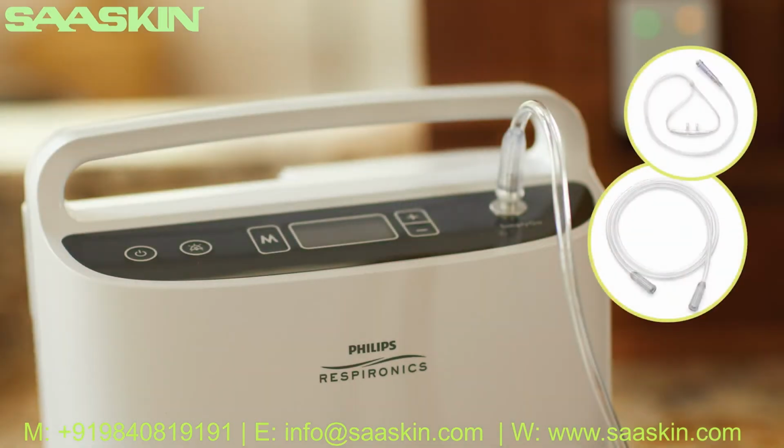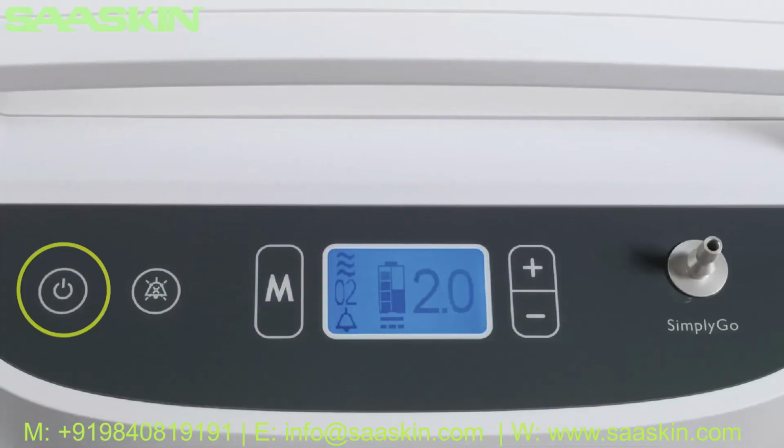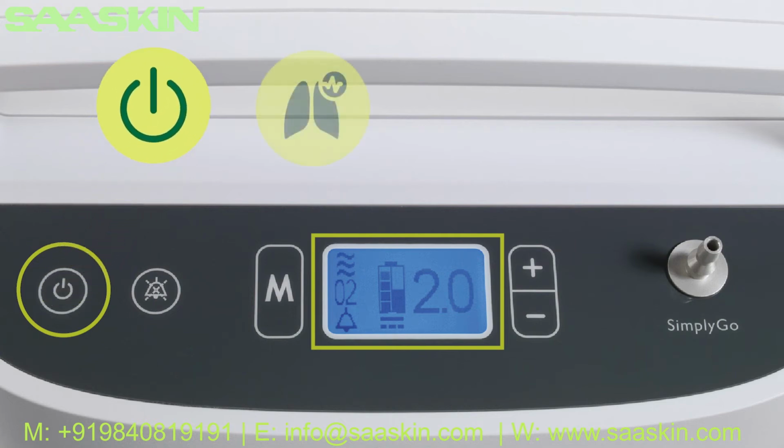Next, connect a nasal cannula to the patient cannula connector on top of the device as shown. Now, press the power button on the control panel. After the first press, the display screen and the 5-button backlights turn on, and you will see a screen similar to the one shown. Next, press the power button a second time to place the device in operating mode.